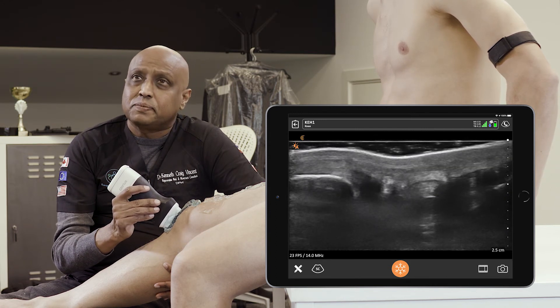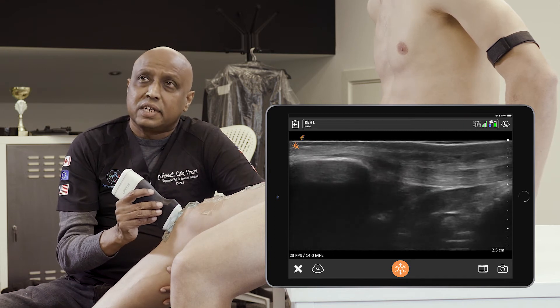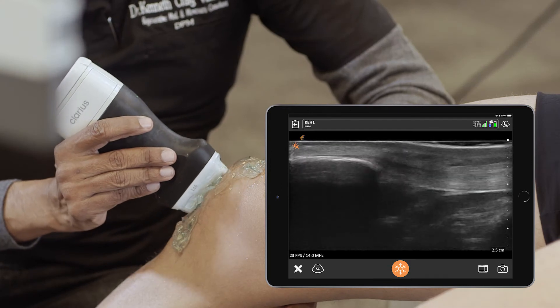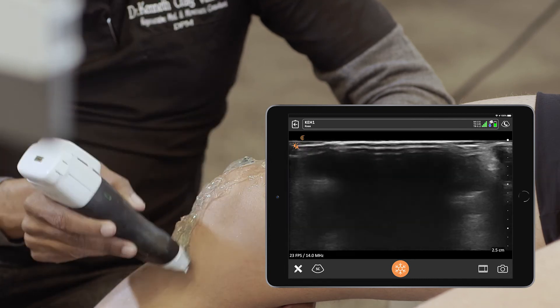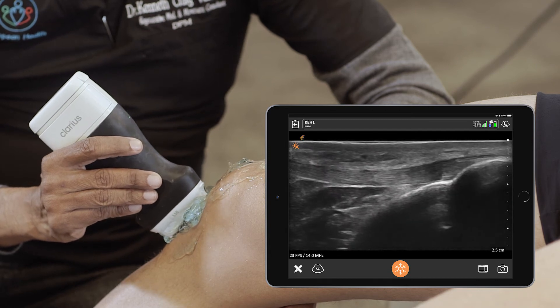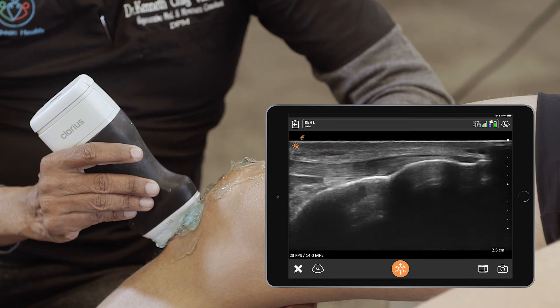From there we move more distally, coming into full contact — we no longer float the probe. We now start to appreciate the patellar tendon. We can see the fibrillar patterns of the tendon at the base of the patella. Beneath the patella is the Hoffa fat pad, and we continue distally towards the tibia at the insertion of the patellar tendon, also a region of interest as pathology does show up here.